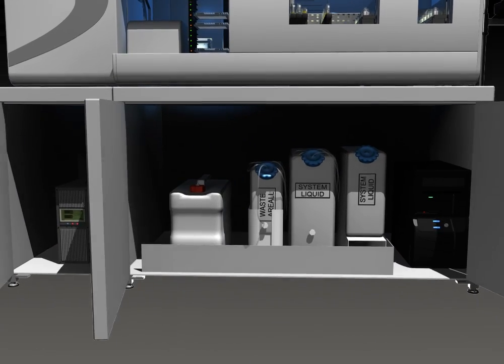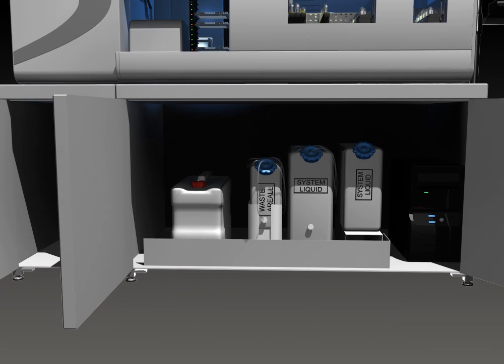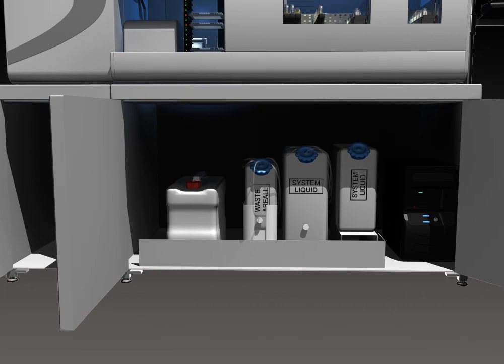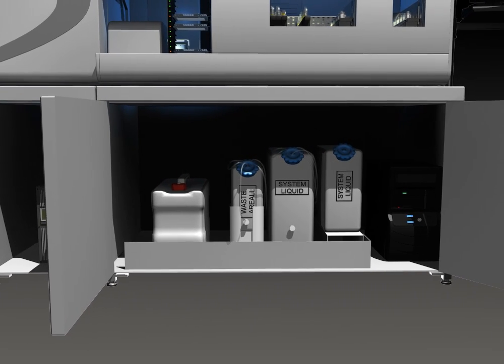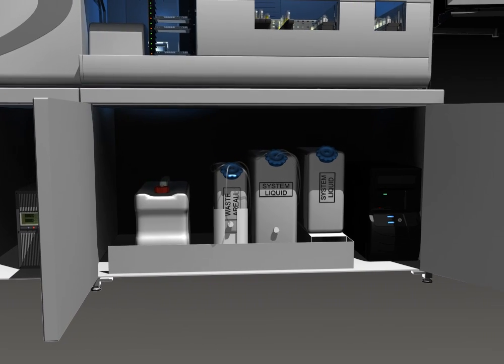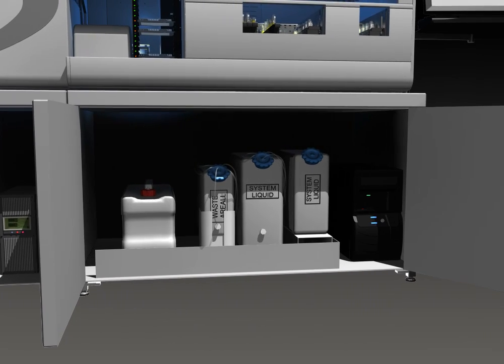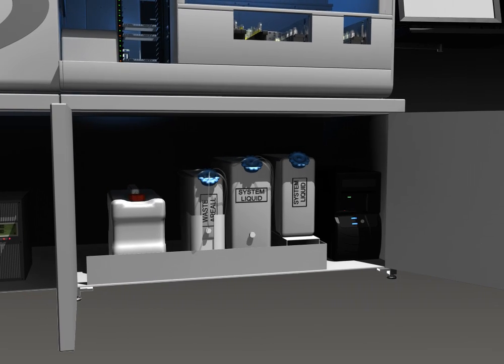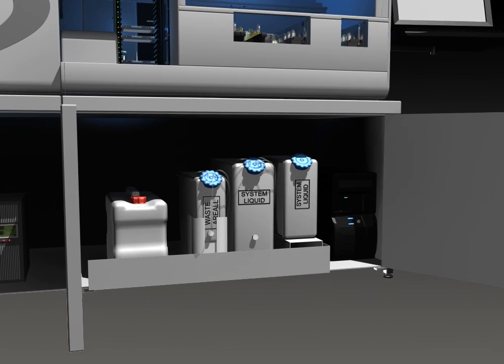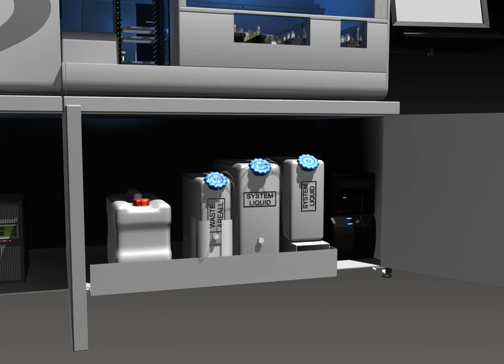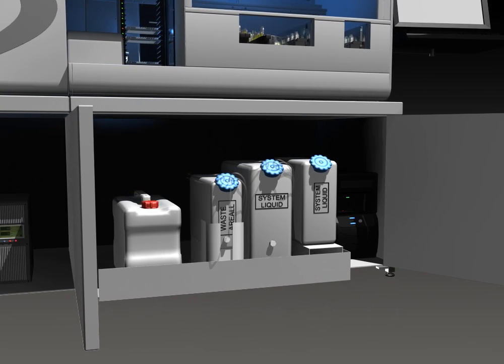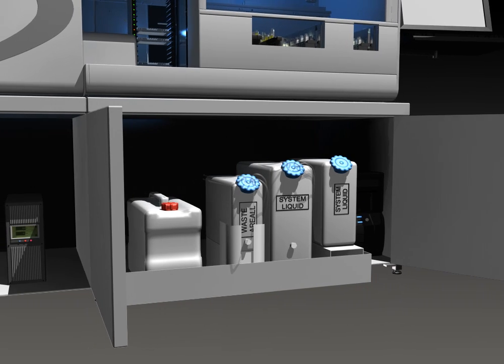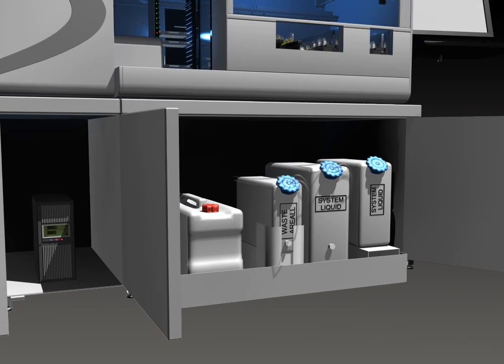NEO's system liquid container houses PBS, the only system liquid that runs on NEO. No special diluents are necessary. NEO also has the option to load a 20-liter cube of saline on board instead of filling the system liquid container.